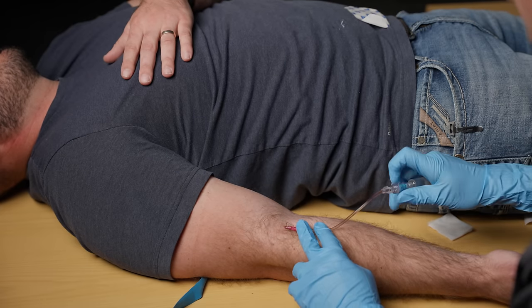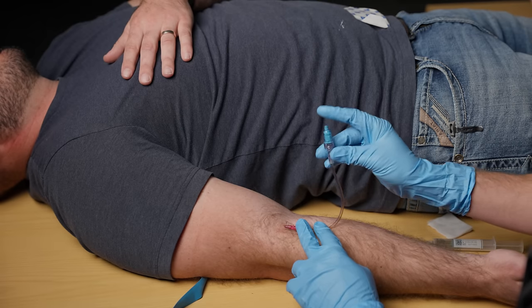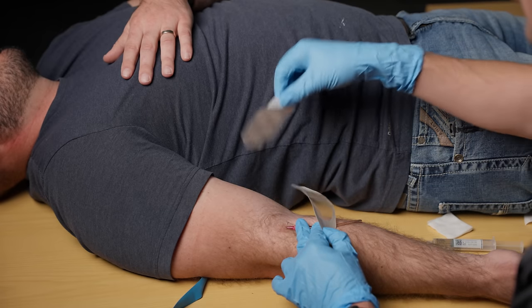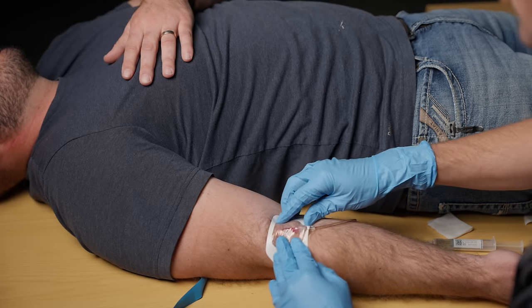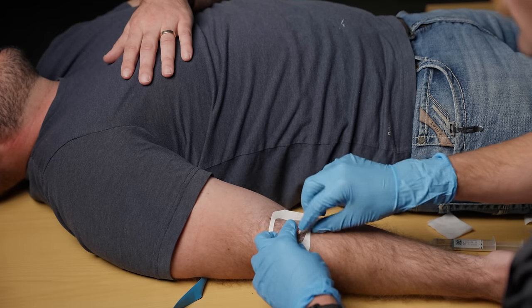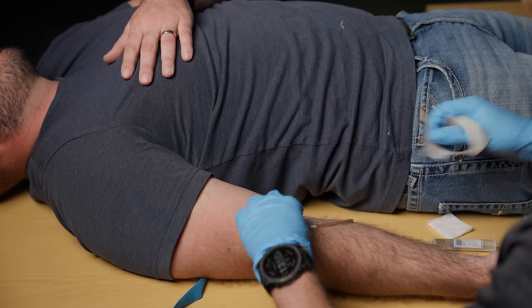I'm going to disconnect the saline flush from this hub — now this is not a clean site so anytime I use that I do want to make sure I scrub it next. I'm going to take my Tegaderm, which protects the site, undo it and put it right over the hub and the start of the J-loop. This keeps this site clean, it's going to keep it good for a longer period of time and will prevent infections or any contaminants from getting in there.